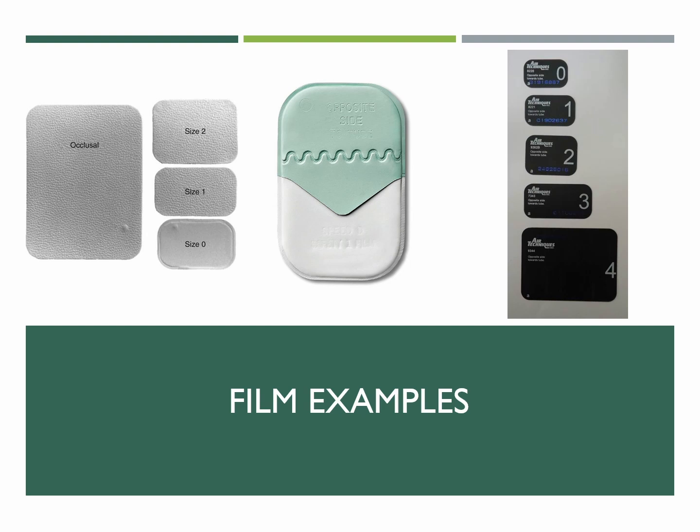Off to the right, we have film, but it's not traditional film. What it is, is CR plates. So CR machines, like we learned last week, are kind of like a hybrid, I like to think, between film and DR. So instead of a direct digital image, you're going to take an X-ray on the plate, but then you have to put it through a processor. Instead of chemicals, it's going to use that excitable light and come up with an image on the computer.